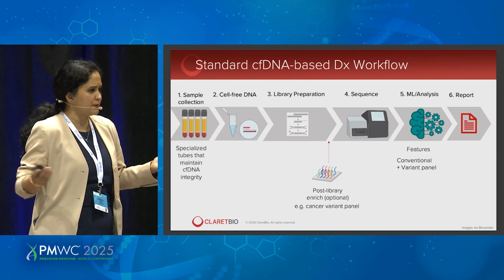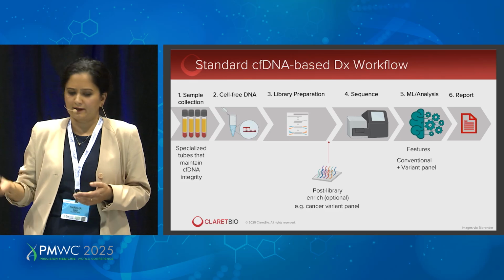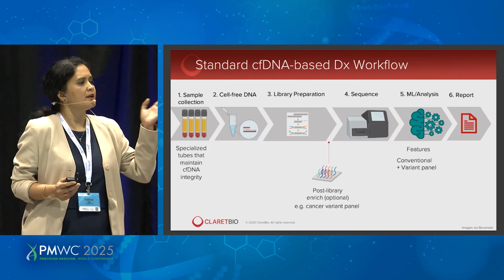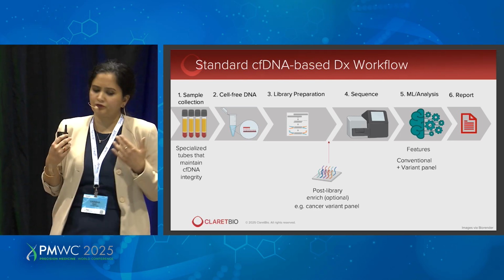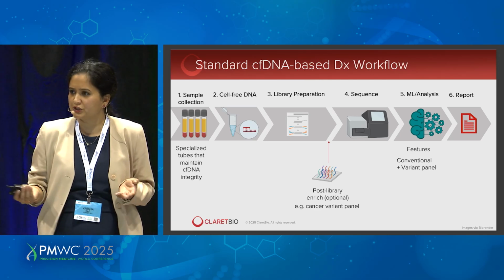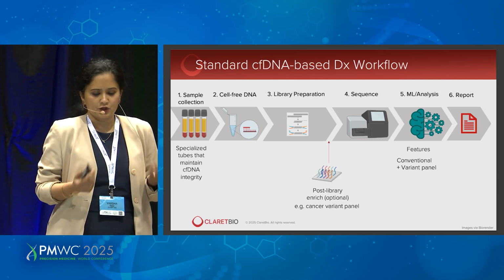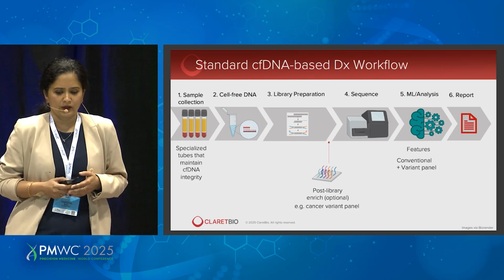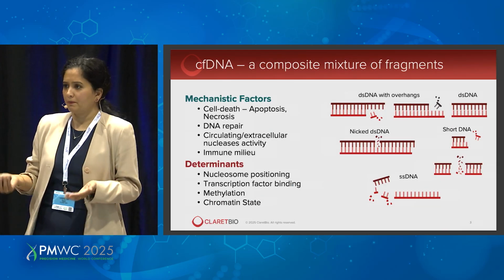I'm sure you are familiar with a workflow of this sort, where you're looking at a standard cell-free DNA-based diagnostic workflow. You start with sample collection, cell-free DNA extraction, library prep. There may be some form of targeted enrichment, or there is whole genome sequencing, followed by capture of features. Usually you're looking at a variant panel, a set of mutations, and so on, going into reports. But cell-free DNA is more complex than that.